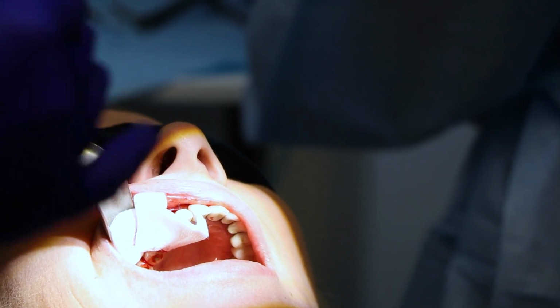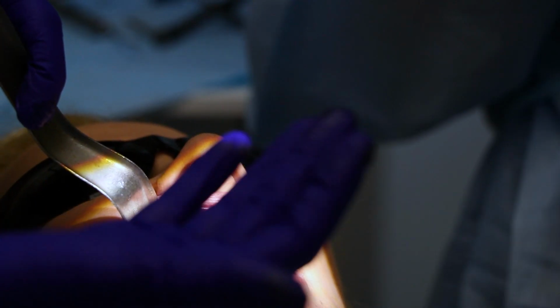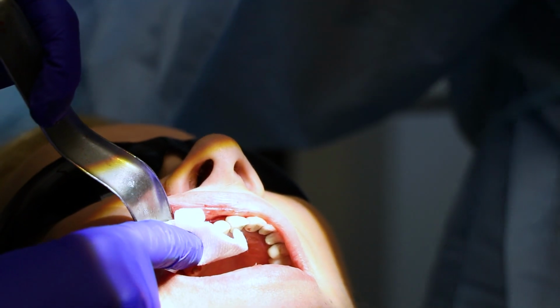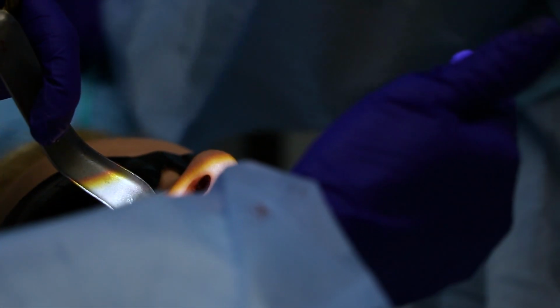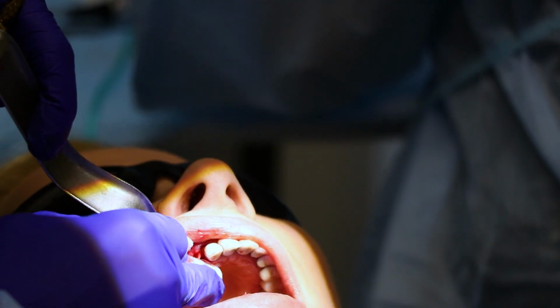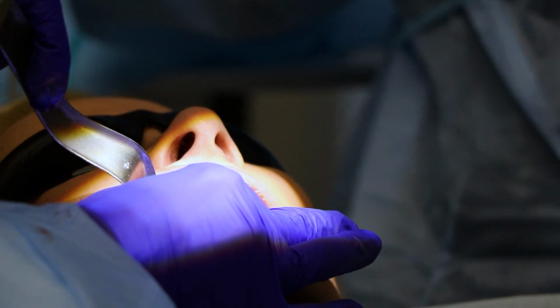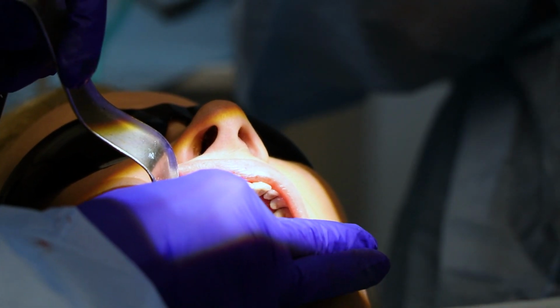Whenever you have an immediate placement, there's an area of gums that's missing because there was a tooth in place. So we have to stretch the muscle over to cover that area so that the implant isn't exposed to the mouth. And that's why sometimes you can have swelling when you do the implant the same day.